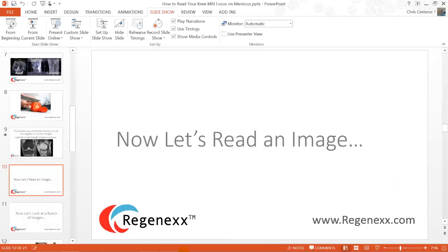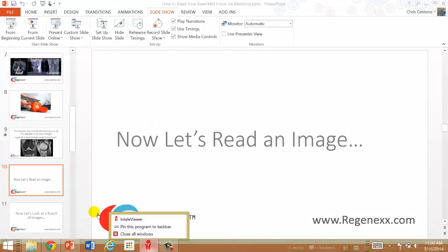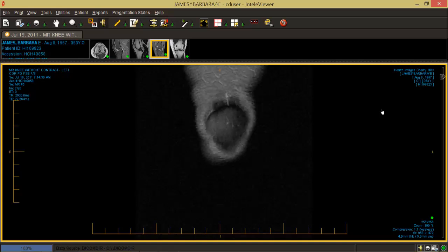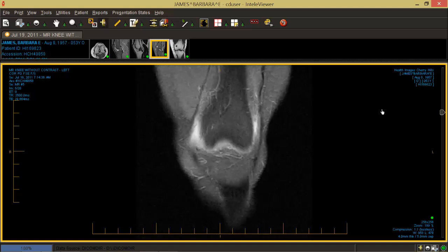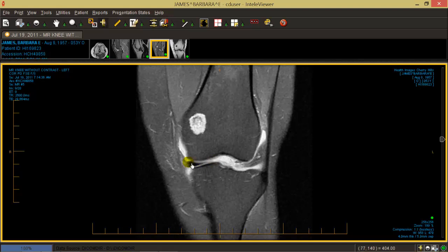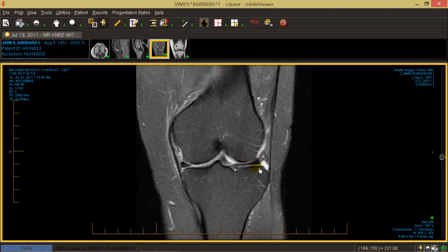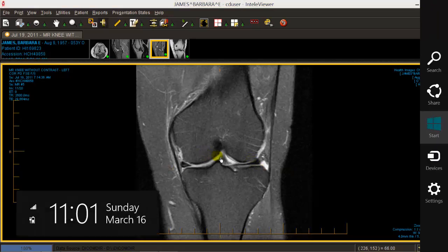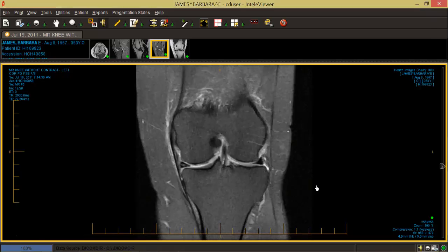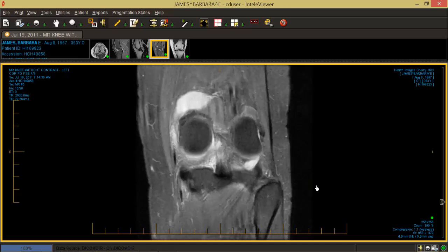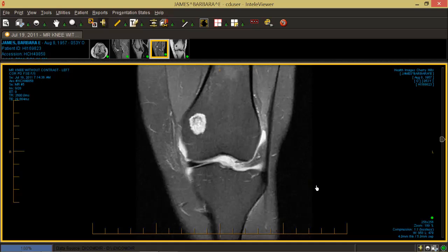Now let's read an actual image. This image has been donated by one of our patients. Starting with the coronal image, where the bone is dark, I'm just going to scroll through. I see the patella — the kneecap — and then the main knee bones come in. I can see this meniscus coming in here as a triangle, and as I go back further I see the other meniscus and another triangle. As I scroll back to front I can get through the entire meniscus.